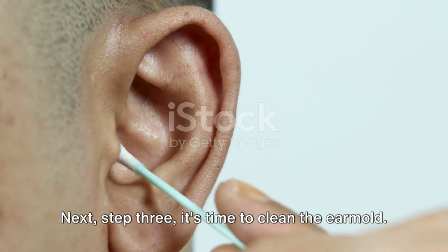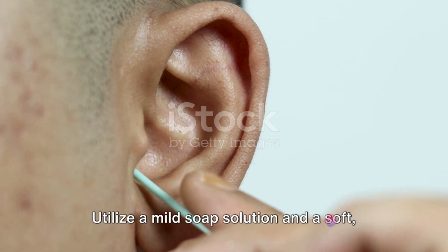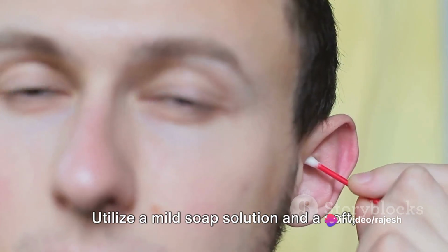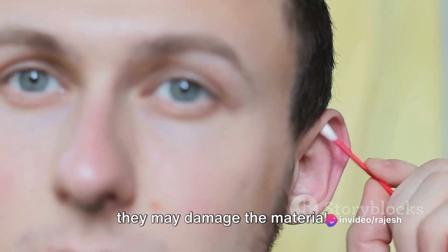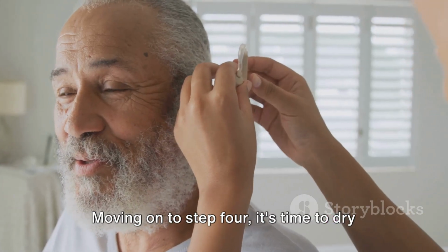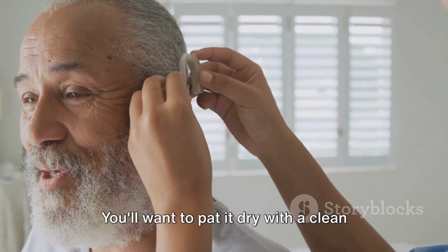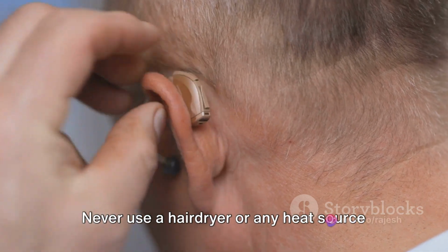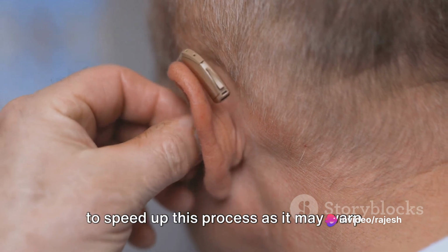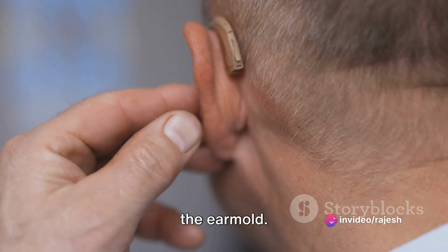Next, step 3. It's time to clean the ear mold. Utilize a mild soap solution and a soft, clean cloth to wipe it down. Avoid using alcohol-based cleaners as they may damage the material. Moving on to step 4, it's time to dry the ear mold. You'll want to pat it dry with a clean towel and then let it air dry overnight. Never use a hairdryer or any heat source to speed up this process, as it may warp the ear mold.